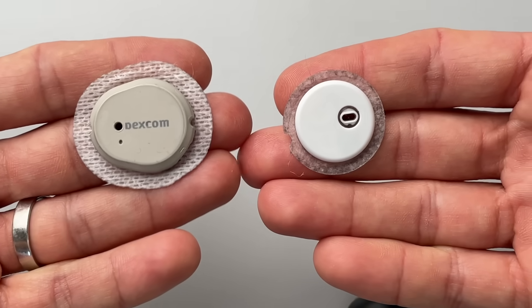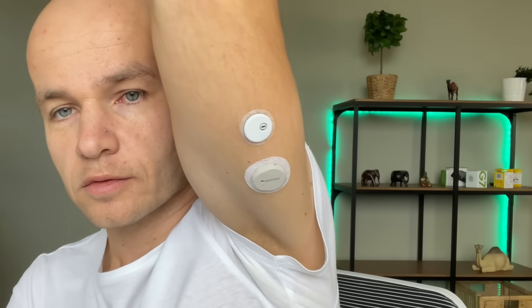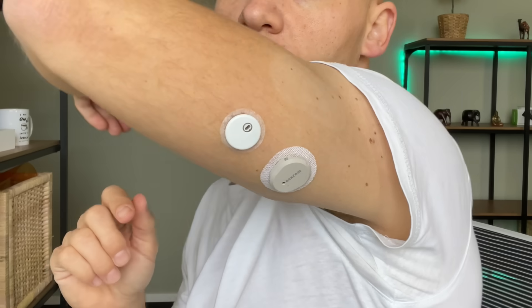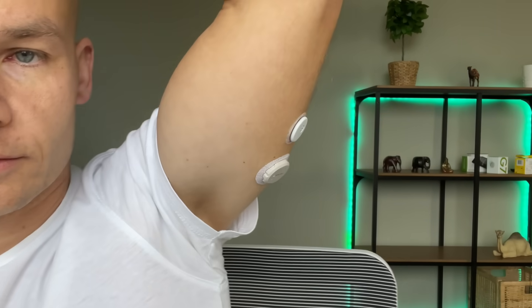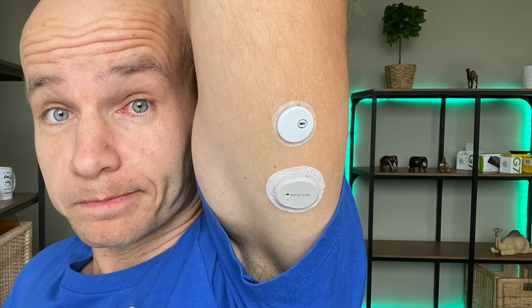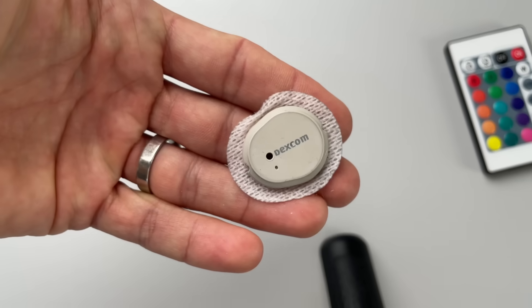Most people care about how the sensors look because that's what we wear on our body 24/7. Both of these sensors are really tiny and super light — when I put them on my arm, I immediately forgot they were there. The Libre 3 is smaller and sleeker when sitting on my arm next to the G7, and although the difference isn't huge, it's definitely easier to bump into something with the G7 and knock the sensor off.